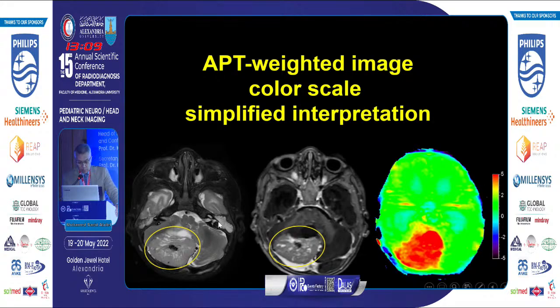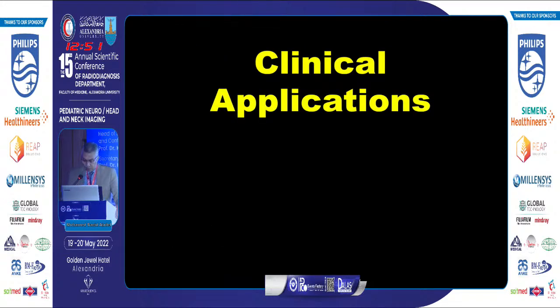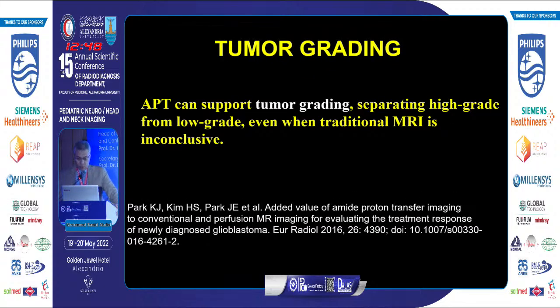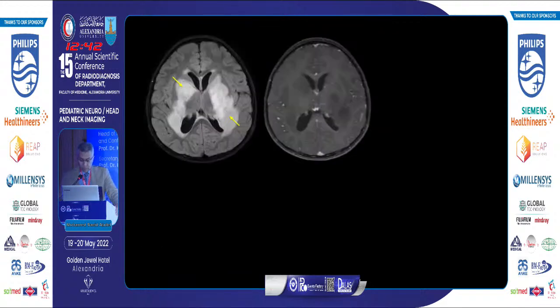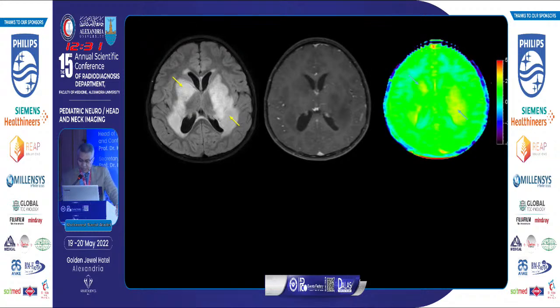This right cerebellar hemisphere medulloblastoma, a high-grade neoplasm, shows high signal within the tumor on amide proton transfer, consistent with high-grade neoplasm. Importantly, amide proton transfer weighted imaging does not require any contrast administration. The first clinical application is tumor grading — separating high-grade from low-grade neoplasm. This diffuse astrocytoma in a patient with neurofibromatosis appears hyper-intense on FLAIR without significant contrast enhancement. The amide proton transfer reveals low signal (yellow color) within the lesion, consistent with low-grade neoplasm.